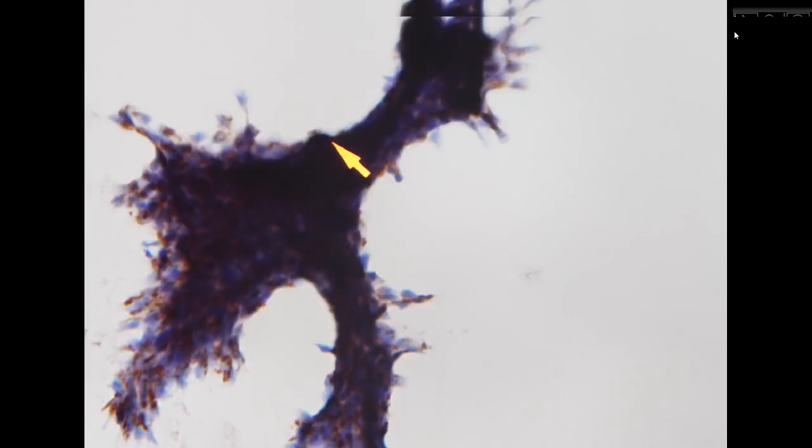So it's an easy preparation. We only need to do the cytospin, and we can do a lot of different immunocytochemistry on this preparation with very good results. So the cells are positive for both GATA3 and parathyroid hormone, which is a definite suggestion for parathyroid origin. So we will send these out. Although the clinician labeled it thyroid, we will send these out as the other location, negative for thyroid and compatible with parathyroid lesion.